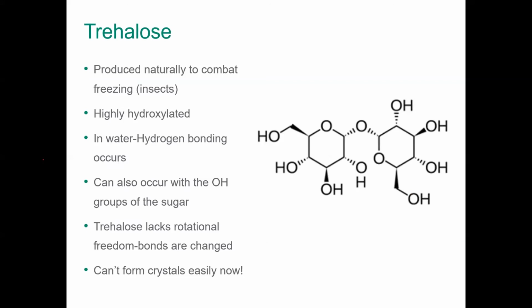We know that trehalose is one of the naturally occurring sugars, and it's found as the blood sugar in insects. We also found that it is present in naturally freezing creatures, some insects that have to go through freezing during a tough winter and then thaw.